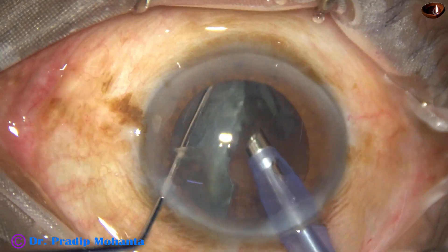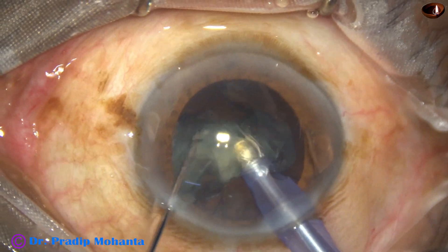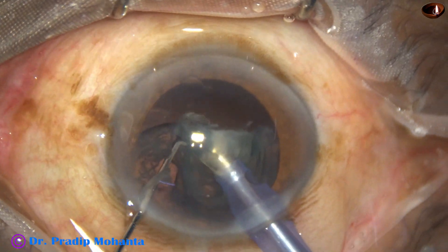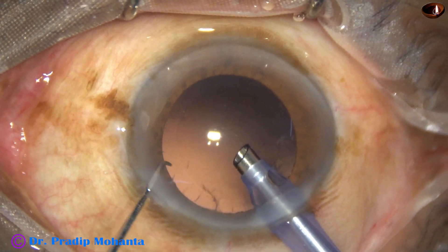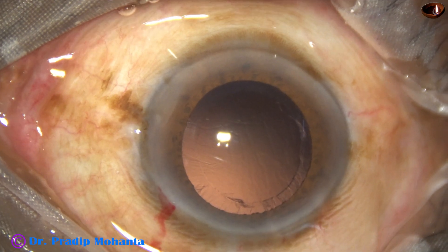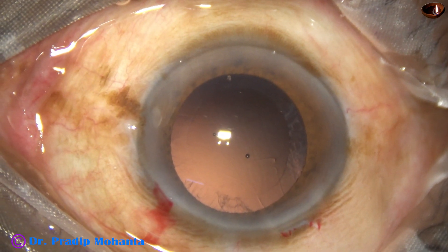The other hemi-nucleus is also chopped and the fragments are emulsified. Now most of the cortex has come out. The anterior chamber is again filled up with visco.